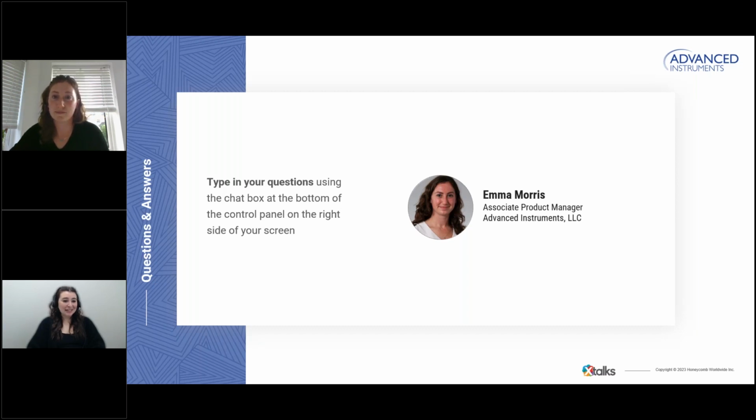Another audience member would like to know, I've been using Instagrow CHO to improve clonal outgrowth. What is the process for switching to using InstaShake for clone expansion? So Instagrow is used during the seeding process. It can then also be used as you expand the clones from the cloning plate into other static vessels. But once you're ready to move those clones into shaking cultures, that is when you would switch from using the Instagrow reagent to the InstaShake reagent.